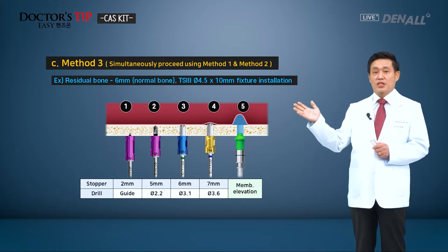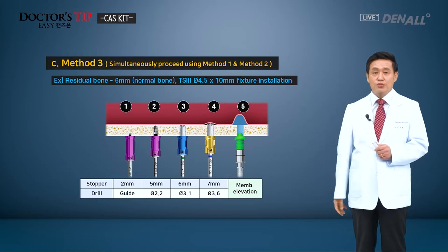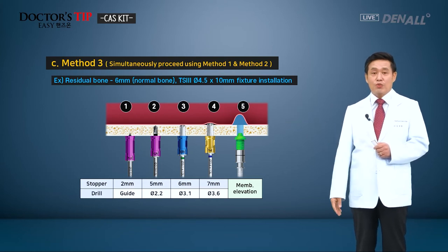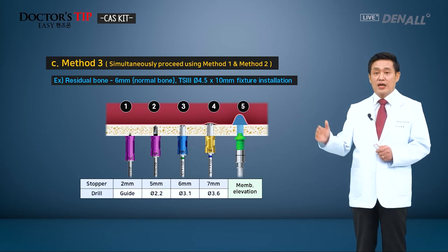Out of method 1, 2, and 3, you can choose whatever fits you, whatever is convenient for you. If you get used to using CAS drills, you will prefer to use method 3 because it has the simplified sequence.